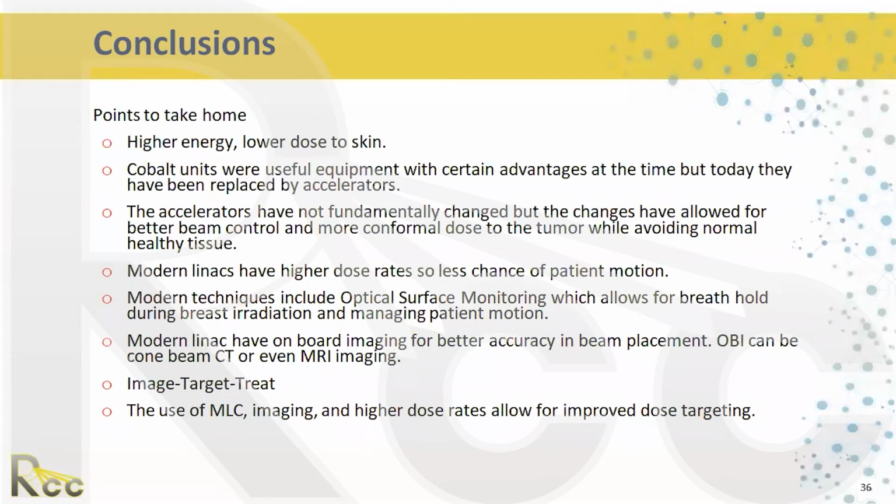Optical surface monitoring, I showed you, with the cameras in the room that look at the patient's surface and make sure that it doesn't change during treatment. Breath hold to get the heart out of the way when you're treating the left breast of a patient. Onboard imaging for imaging, targeting, and treating. The use of multi-leaf collimators and higher dose rates to improve dose targeting.